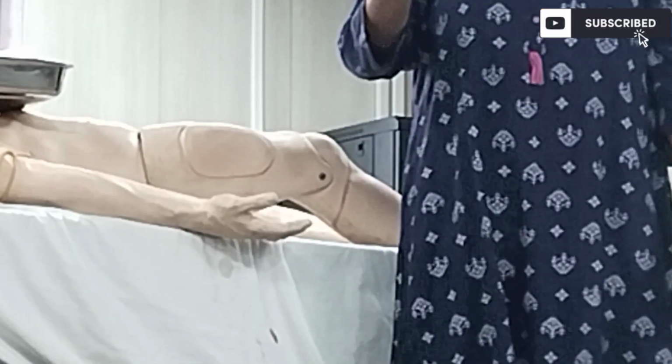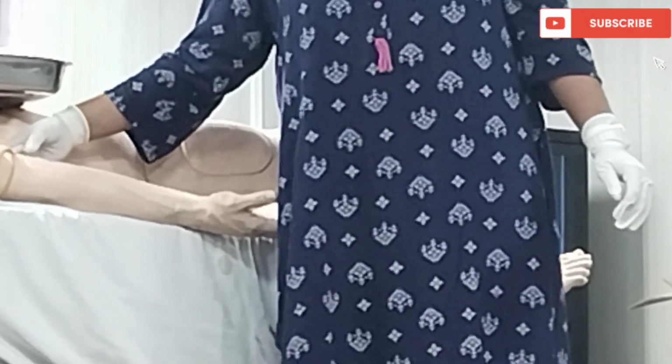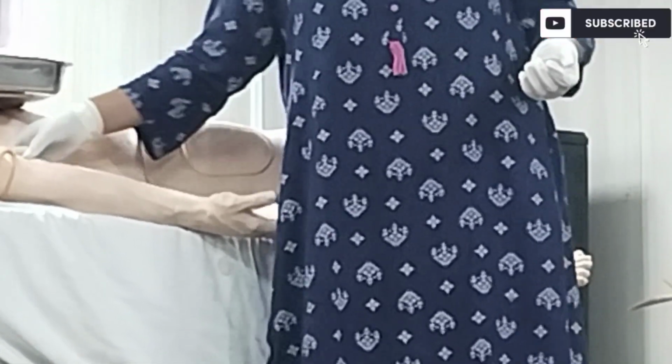Usually, while drawing blood, we go for the veins that are palpable, rather than just visible. If it is palpable, then it is easier.